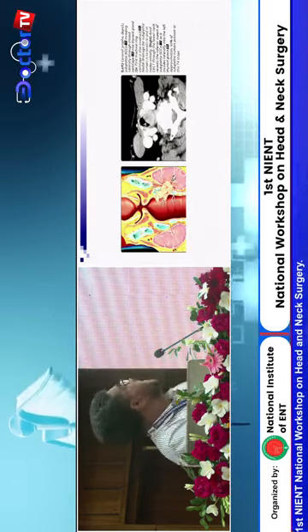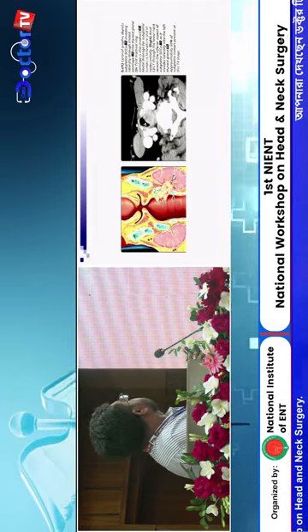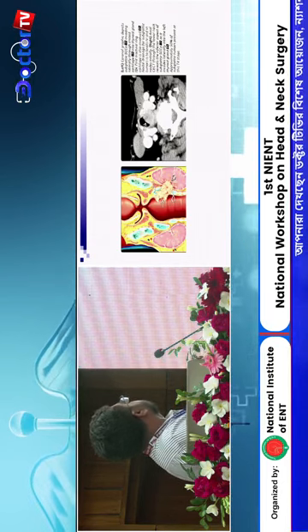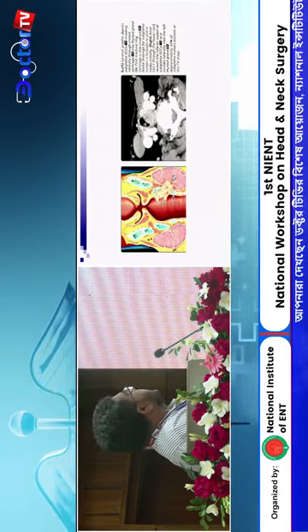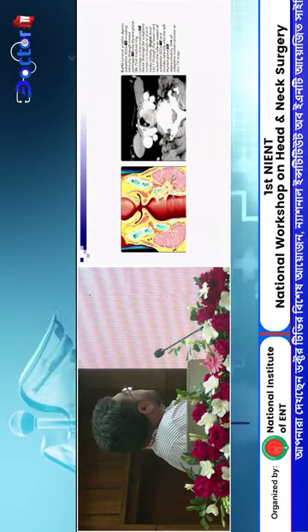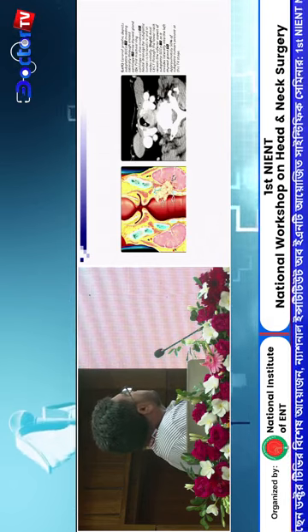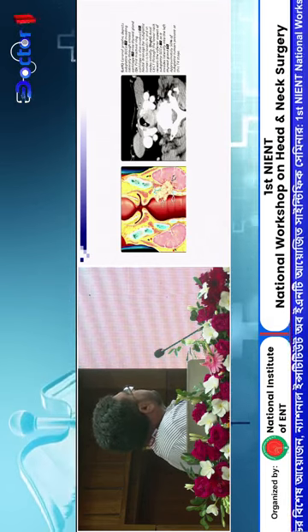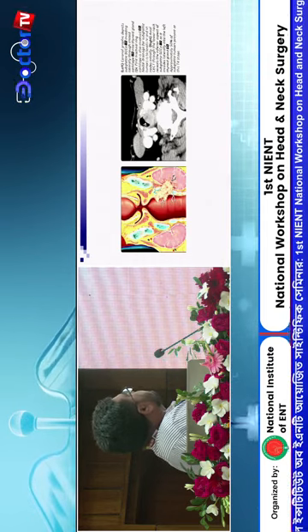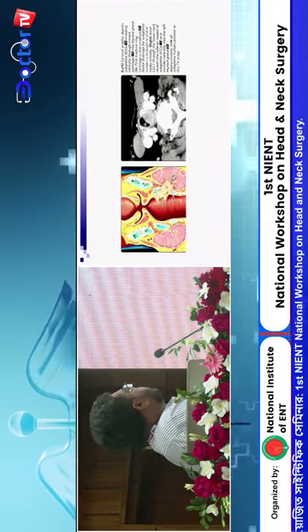And here you see a graphical subglottic tumor. This is the true glottic fold. Below is the subglottic tumor up to the lower border of the cricoid cartilage, and we see in an axial contrast CT scan a tumor in the subglottic area. There is a circumferential cartilaginous ring, so it is the subglottic area, and also we find the thyroid lobe there. The lesion tends to invade the left lobe of the thyroid gland.